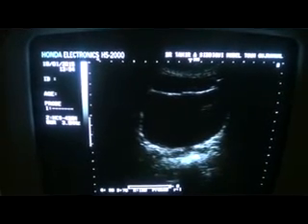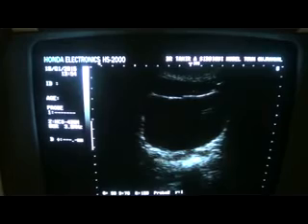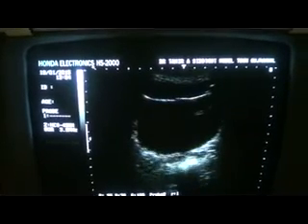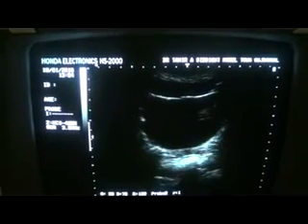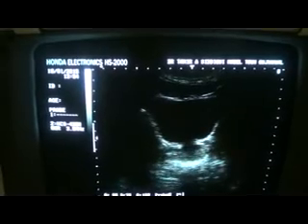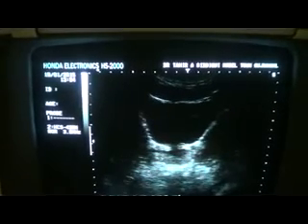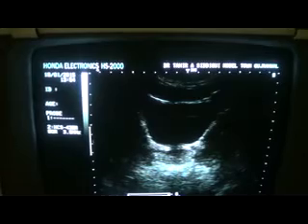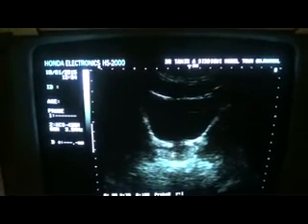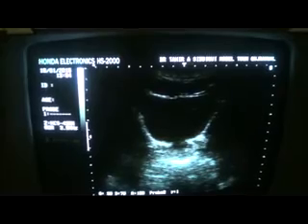Here I come across a mustache-shaped structure. This is the seminal vesicles. When I go further down, I come across a globular area which is the prostate in this particular patient. This globular area is the prostate in transverse section.